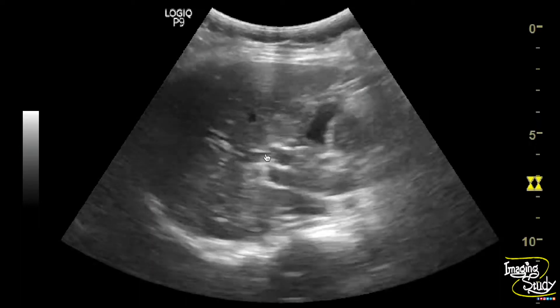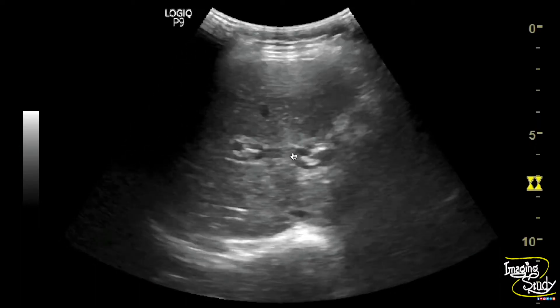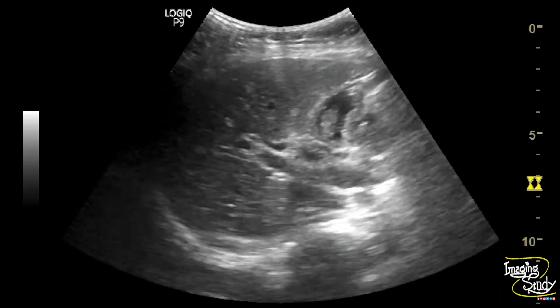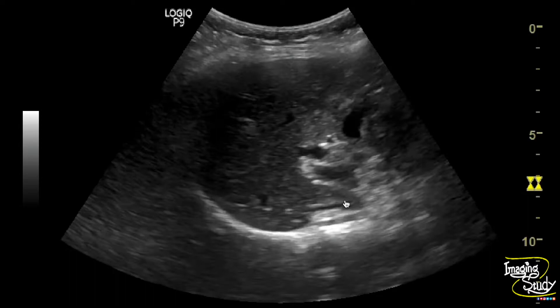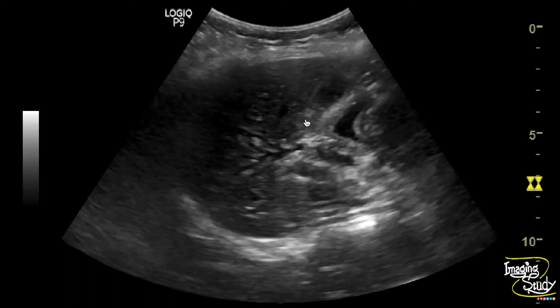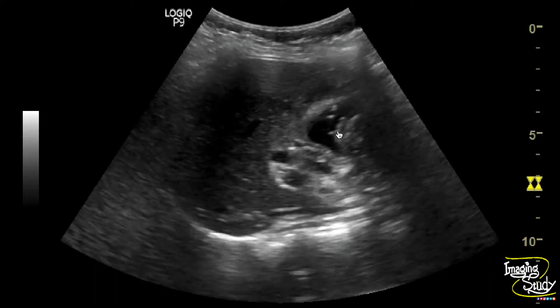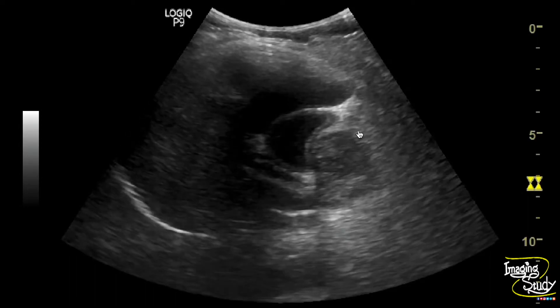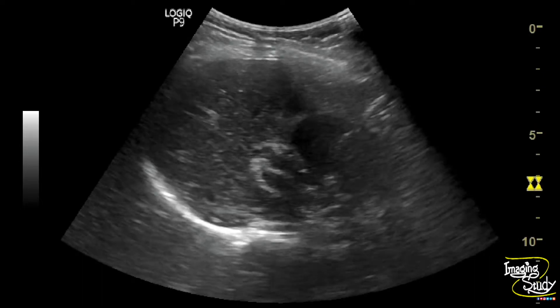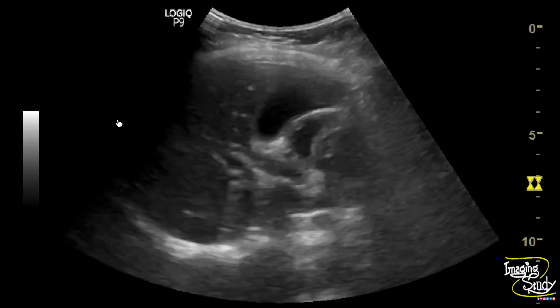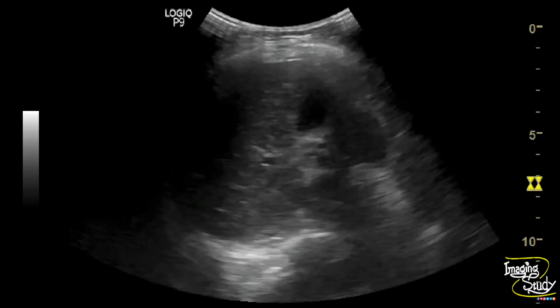Here you can see the part of the liver. The parenchymal echotexture looks coarse and you can see the intrahepatic bile ducts are dilated. This is the gallbladder, and you can see the fluid-filled duodenum mimicking the gallbladder. Overall, the parenchyma is coarse, indicating chronic liver disease.